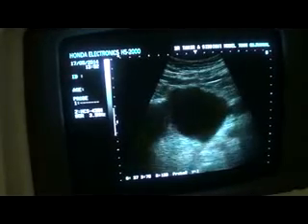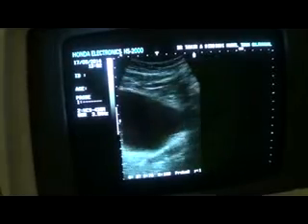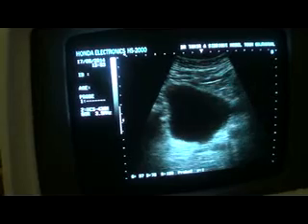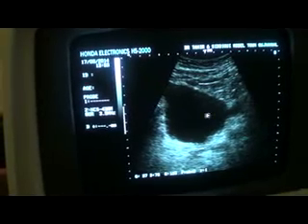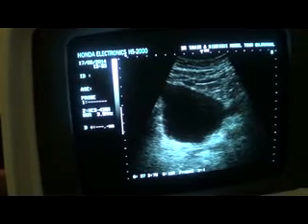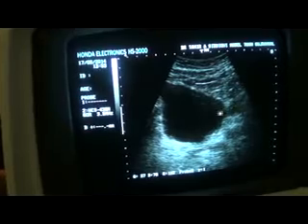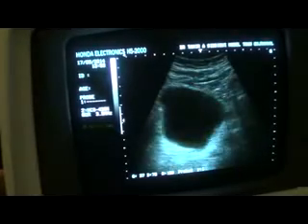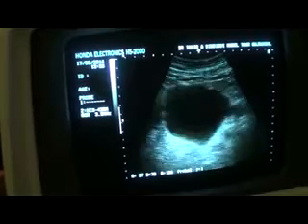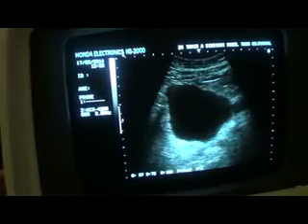Now one thing that one can read is the insertion of the ureter into the urinary bladder. It appears to be an ectopic insertion, because during the course the left ureter is posterior to the urinary bladder, and here lies the ureteric junction. You can see that this dilated distal ureter is entering, in the transverse section, clearly seen it's entering the upper part of the urinary bladder here.